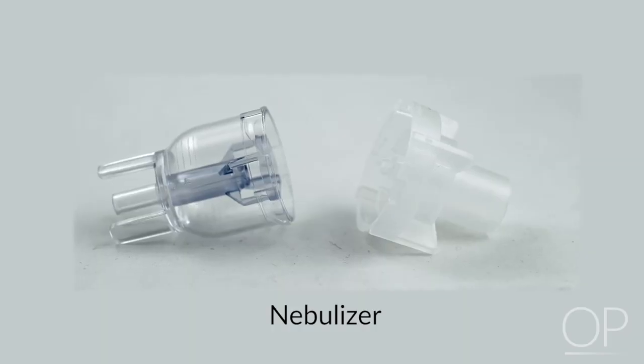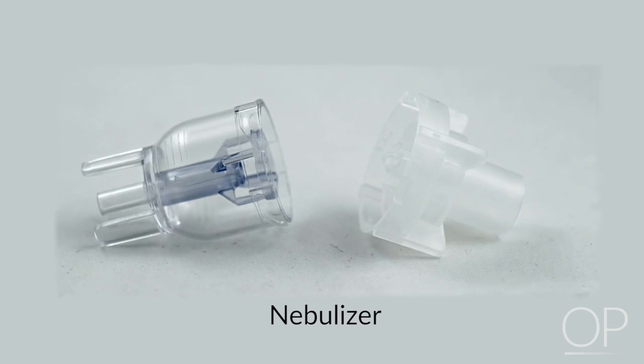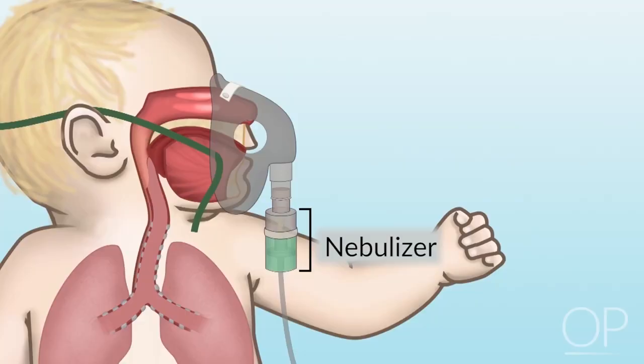A nebulizer is a device used to administer medication in the form of a mist or an aerosol. There are many different types of nebulizers, and I'm going to describe only a few today. All nebulizers take gas, typically air, or oxygen, or perhaps heliox, which is mixed with a liquid suspension medication, and then forms an aerosol for delivery to the patient within the lungs themselves.